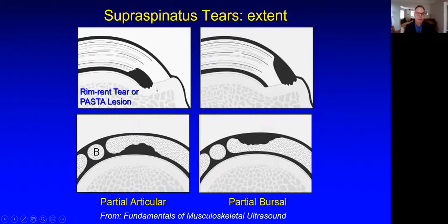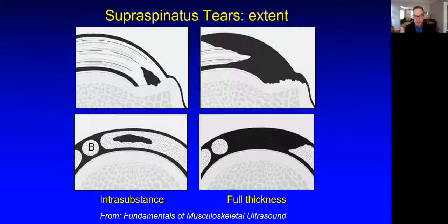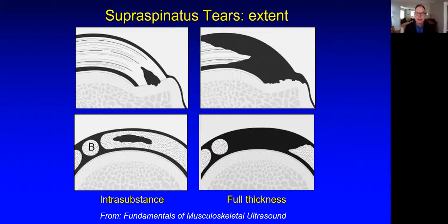In contrast, a bursal-sided partial thickness tear will be in contact with the bursal surface but not the articular surface. Note that it is in contact with the greater tuberosity surface, but it's not a full thickness tear because it does not connect from the bursal to the articular surface. Note again the cortical irregularity, an important indirect sign. You can have a tendon tear buried within the tendon or at the footprint touching the greater tuberosity, but not touching the articular or bursal surfaces. Then you have the full thickness tear, which goes from the bursal to the articular side, and it can be the entire width of the tendon or more focal.